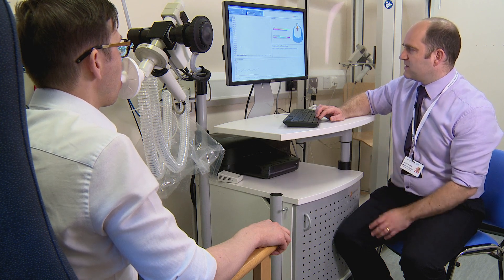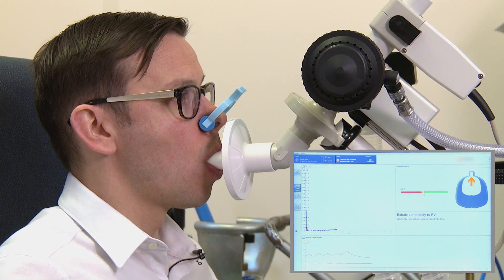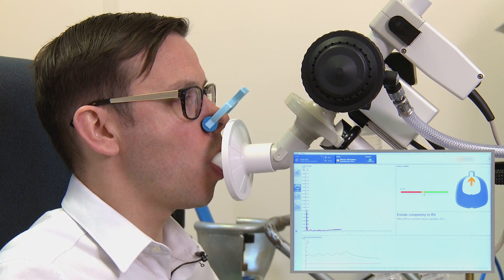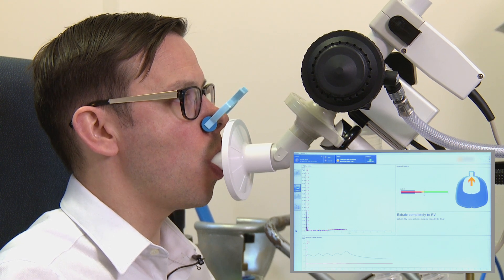Empty out as far as you can. Empty, empty, empty. Keep squeezing now for as long as you can. Keep pushing. It's still coming, still coming. A few more seconds, if you can keep this going, keep it going. Lips tight. When there's no more left, nice big deep one in for me.